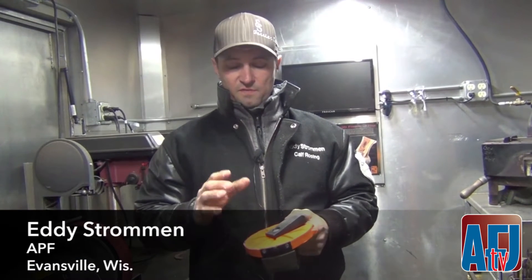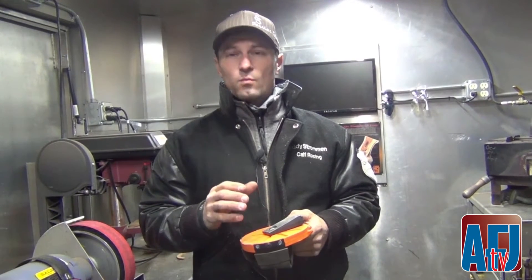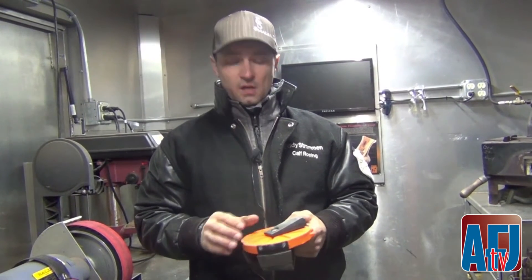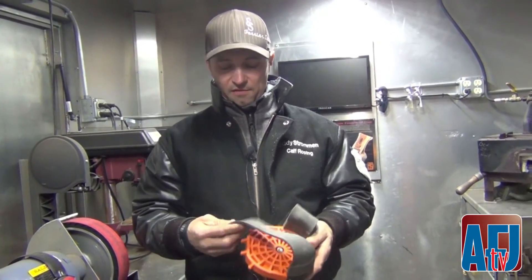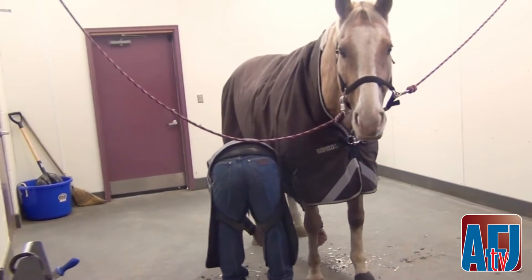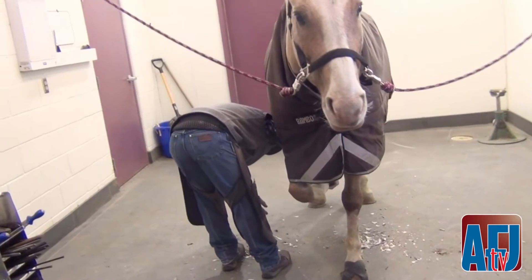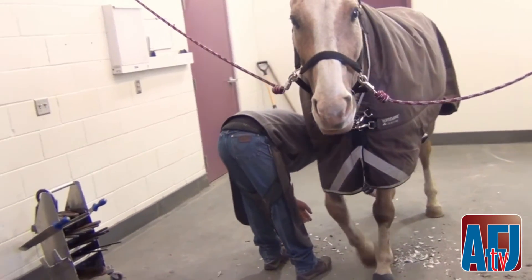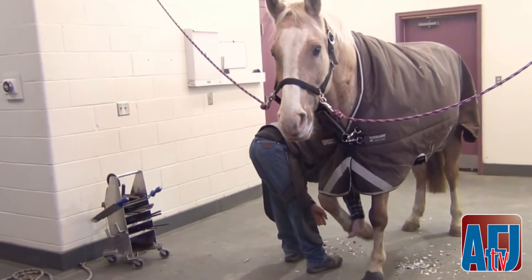It is another way for us to assess the horse's foot in a way that radiographs might not always give us the information. It's easily clipped on the foot, and then you have eight different settings where you can raise the angle of a foot to find out what the horse likes and doesn't like — loading soft tissue and changing the balance of the foot.